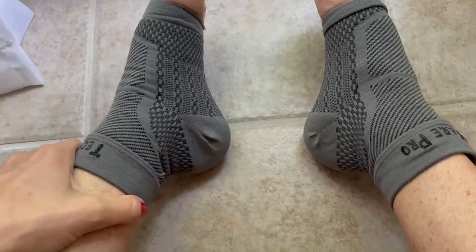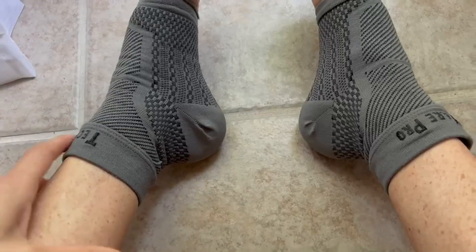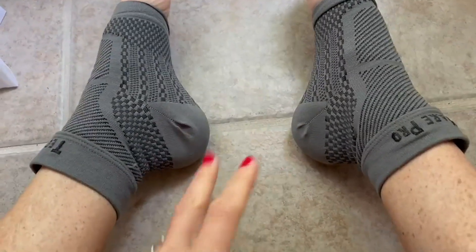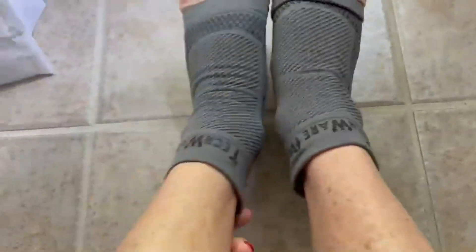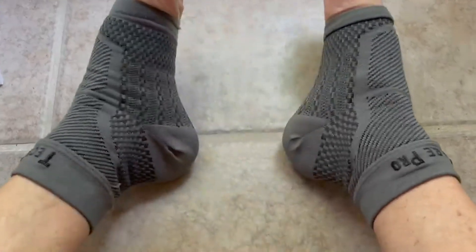Then I didn't have to use them until recently — about a four-month gap in between. They're just nice to have on hand, especially if you're preventing injury or had one and don't want it to happen again. A really great option — can't beat the price, quality is great, and they've been really helpful. Hope this review helps you.